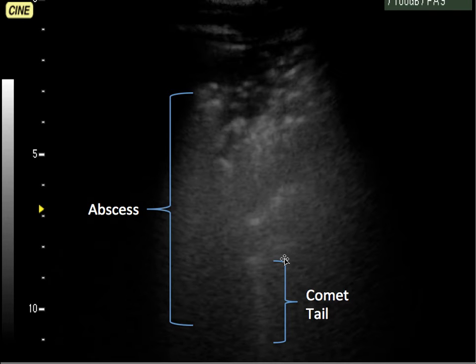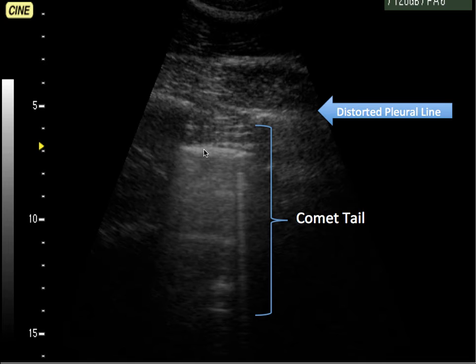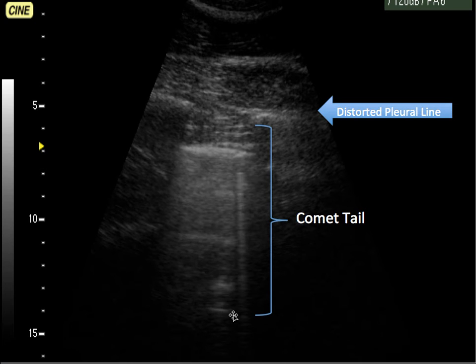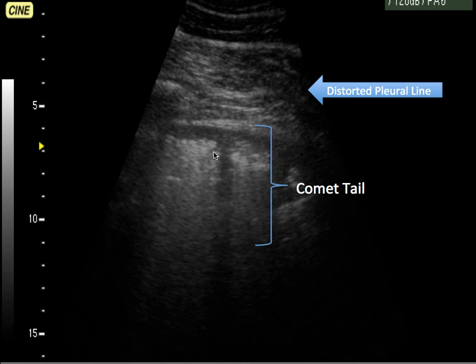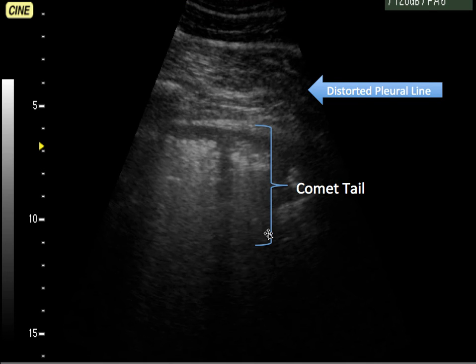The comet tail is indicative of some kind of effusion happening in the lung. Here is our third image, and again we see the comet tails looking like comets streaking across the sky. And again, our distorted pleural line — just another example of what that distorted pleural line looks like in an abnormal lung. Here we have our fourth and final image, pointing out the distorted pleural line above and the comet tail streaking below.